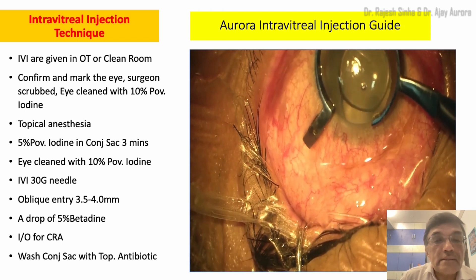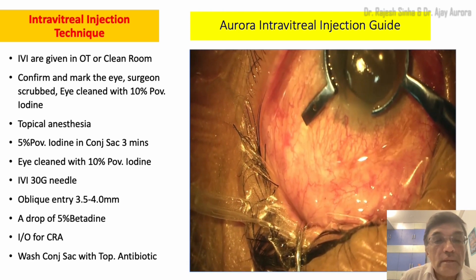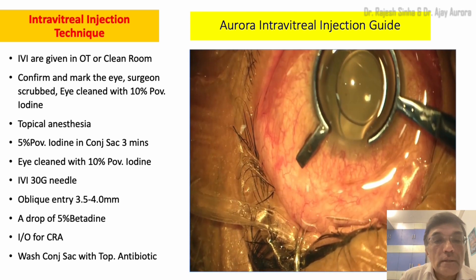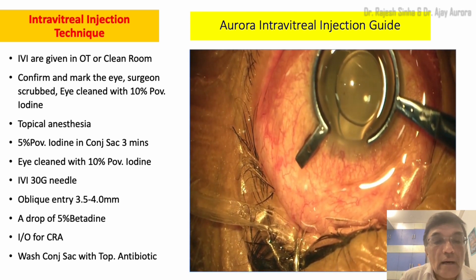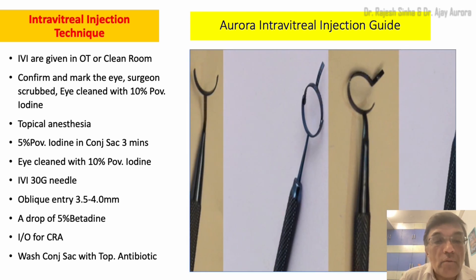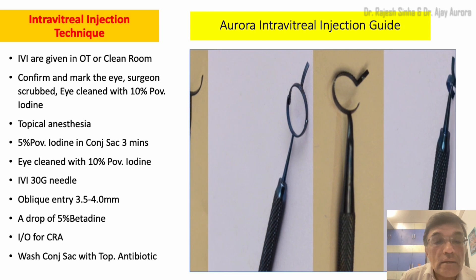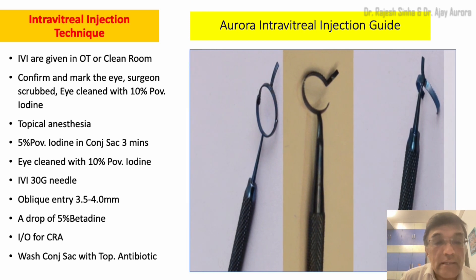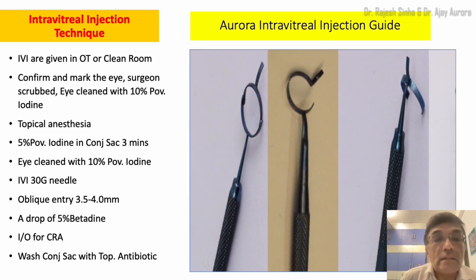Having given the injection, we move the side arm and come out. You can see that the globe is quite nice — it's tight and clear.